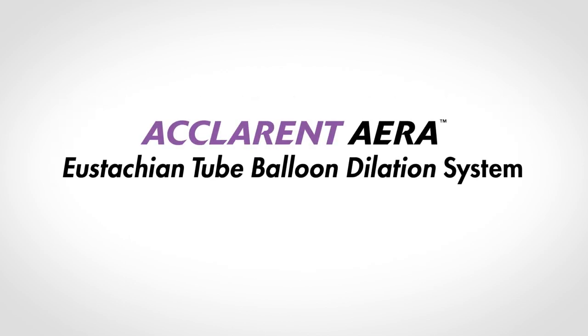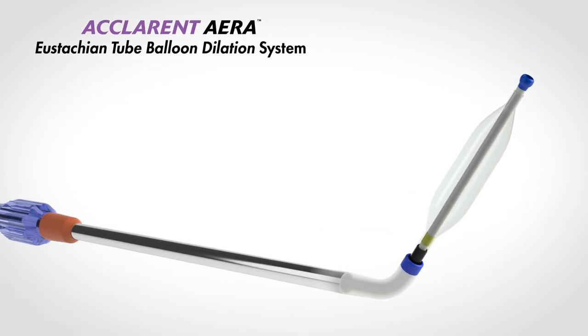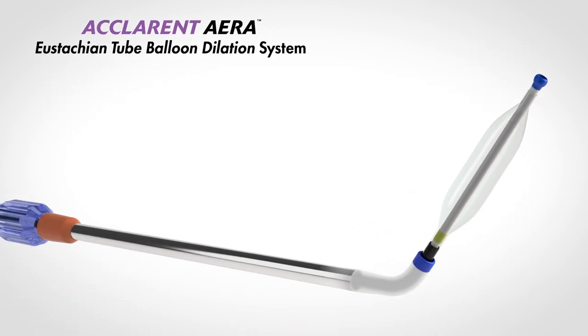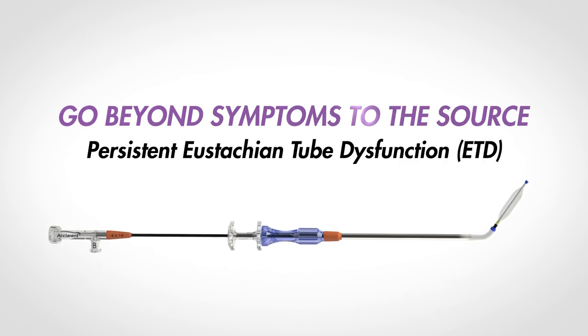Acclarent AERA is the first balloon dilation intervention indicated for persistent eustachian tube dysfunction in the United States. Acclarent AERA goes beyond symptoms to the source.